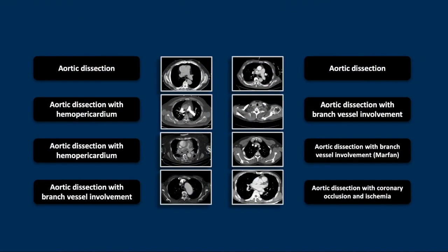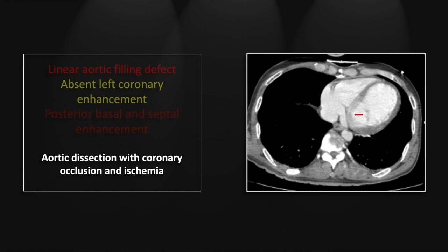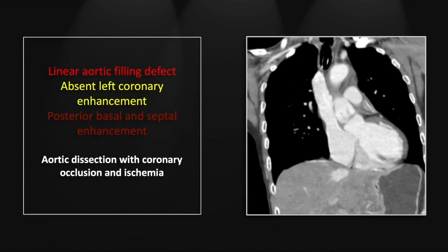Our last case is an aortic dissection with coronary occlusion and myocardial ischemia. Plainly visible is a linear filling defect in the aortic root, which at its leftward aspect can be seen to clearly pass over the left coronary ostium. In this plane you can appreciate the left main and its bifurcation, and none of these vessels shows any contrast opacification. Lower down you can see normal enhancement of the proximal septal and the posterior and inferior wall myocardium, with relative hypodensity of the remainder of the left ventricle consistent with occlusion of the left main.